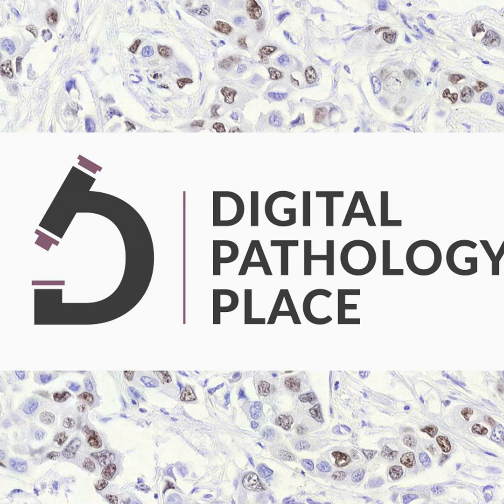I would say the Roche solution there is linking the design of the assay with the scanning and the algorithm by design. Because what that does then is, in my mind, it de-risks the lab's decision on which assay to choose, which scanning system, which algorithm, right? You may pick this stain, run on this stainer, you add on this scanner, you file it in this format, you run this algorithm. It might work, like it might work fine, might not.